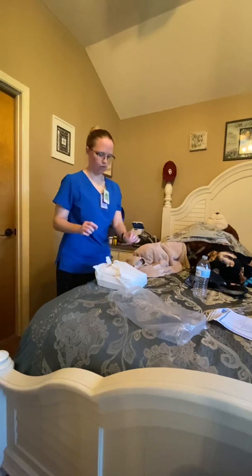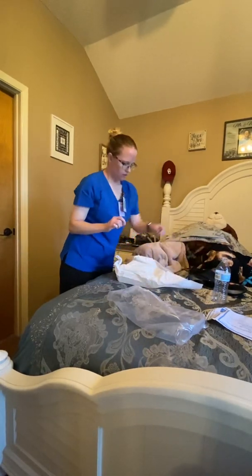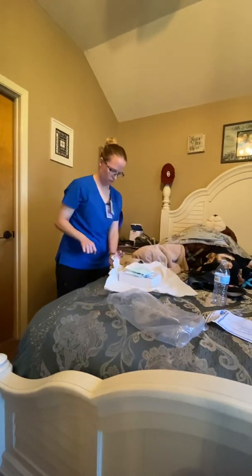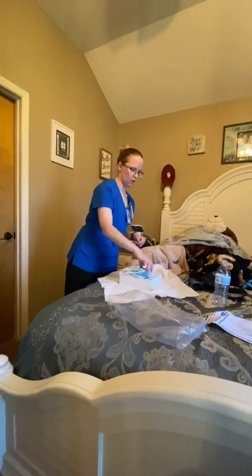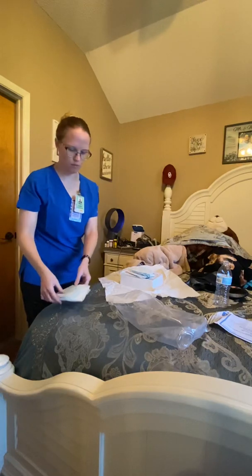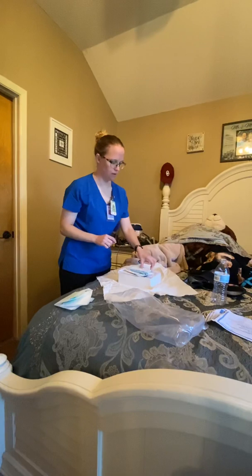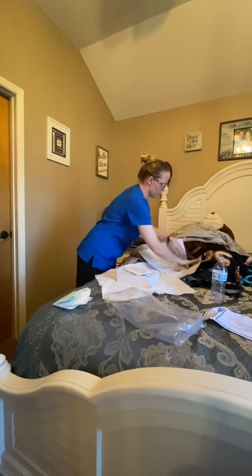Okay, so whenever we're getting this sterile kit, it's a sterile field, so we need to get it from the tips, touching as little as possible because it's a sterile field. And our gloves are going to be on the bedside table. We're going to act like this is our bedside table because they can't touch the sterile field. And we're going to place the drape with the shiny side down underneath the patient's buttocks.